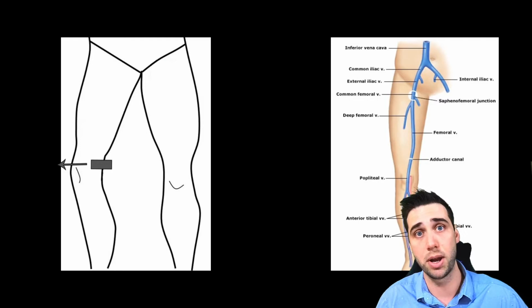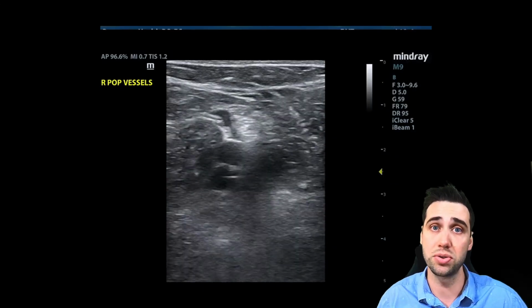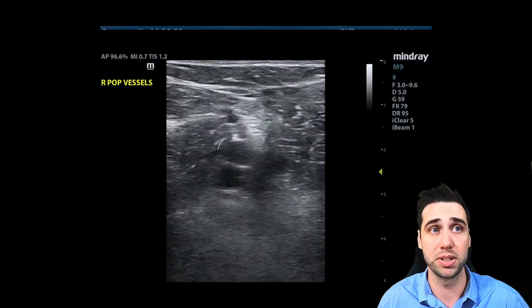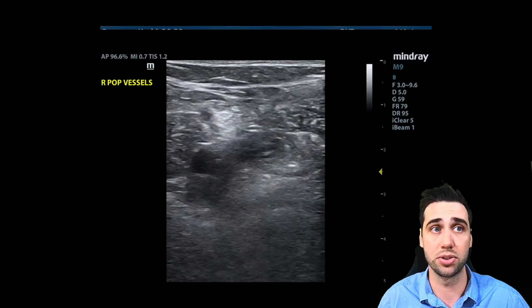The last spot we're going to go is the popliteal vein. To get the popliteal vein, you really have to prove to whoever's watching your clips that you shot it all the way through. To do that, first you find a shot like this where you see the popliteal vein right here on top of the popliteal artery, and you just compress it like they're doing in this clip.